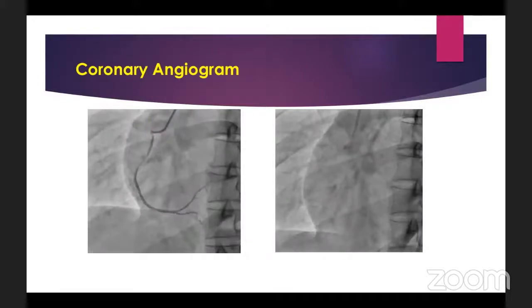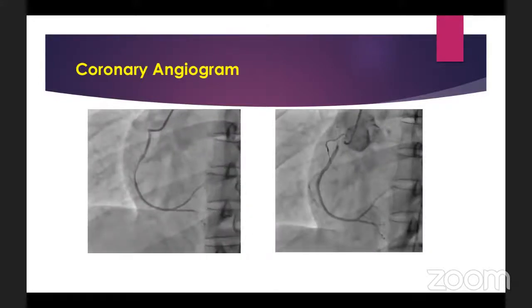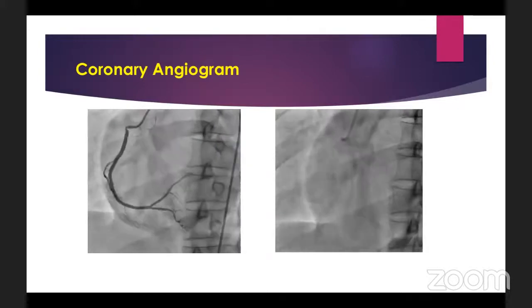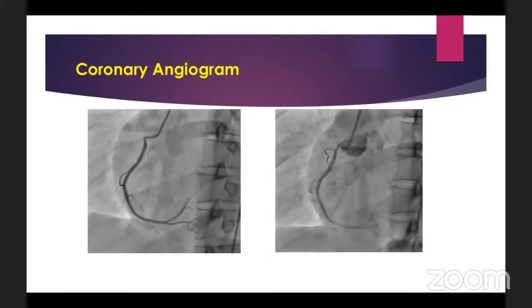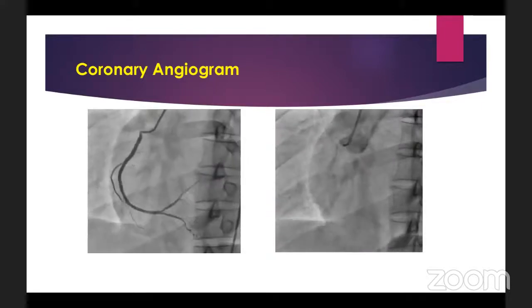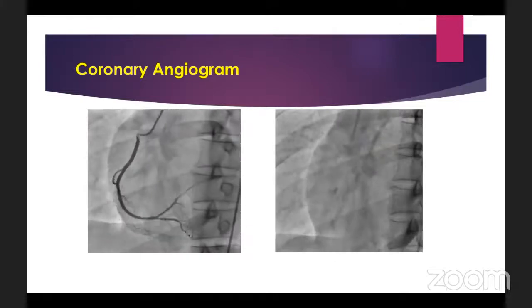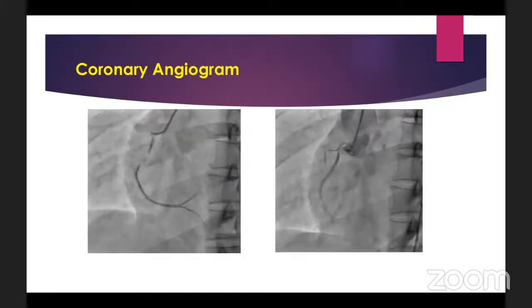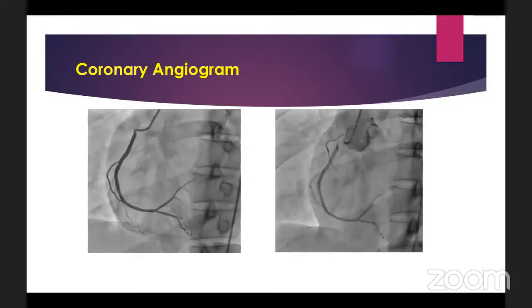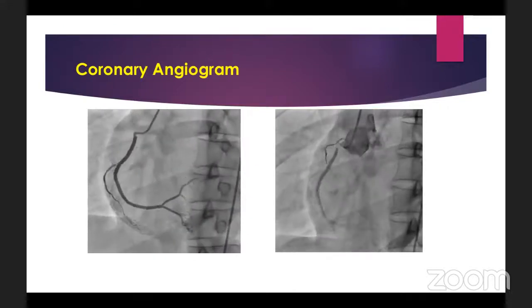So if I have to stent, I have to cover that. The only thing, it might be worthwhile taking a shot after GTN or intracoronary nitrate, just to make sure there's no catheter-induced spasm. Doesn't seem to be, but it's worth probably taking a shot with some GTN.